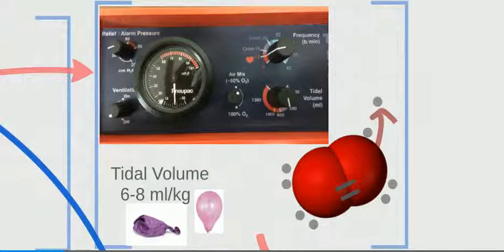And in fact, that's what our medical director at the time would have liked us to do, especially after we obtain ROSC and we put these on our patients. We're going to be using them at 100% FiO2, because very rarely are we going to be transporting critical patients that have already been set up on a ventilator with this ventilator.